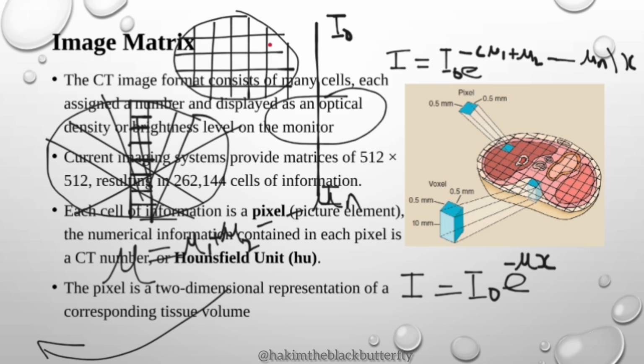Fast Fourier transform equations are not only for changing information from one form to another, maybe from the spatial location domain to a frequency domain. Not only that, but also to do these calculations, the system can use the same equations.